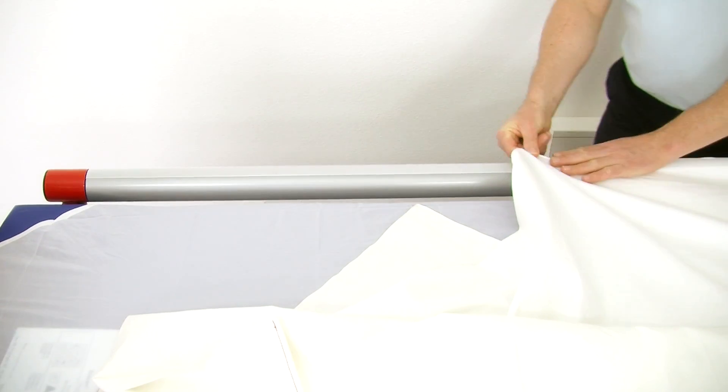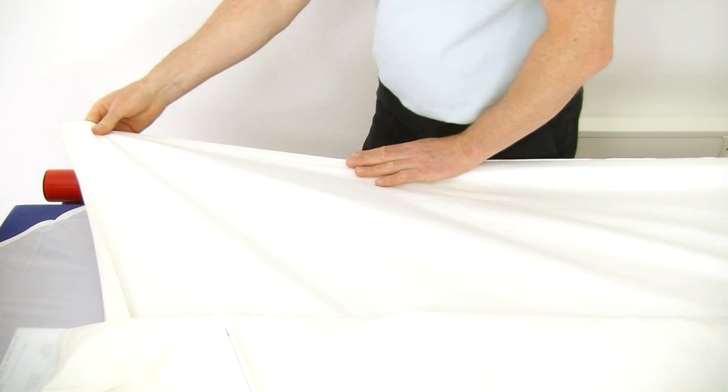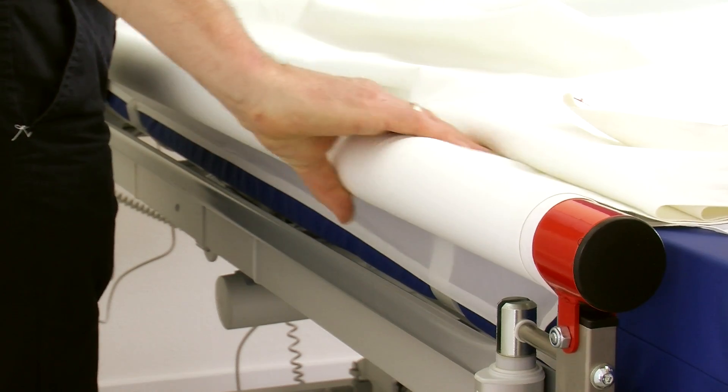Start all the way at the head end and roll down towards the foot end. The turning sheet should always roll over the bars. Roll about 75% of the sheet onto the bar while lightly straightening the sheet.